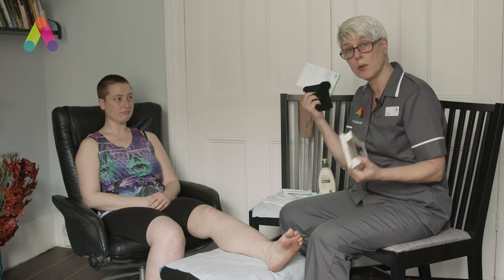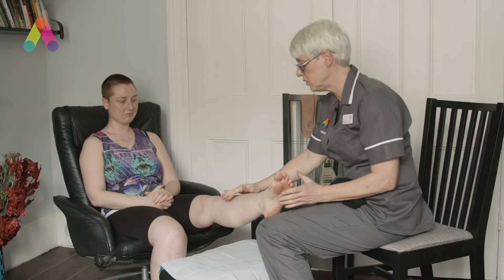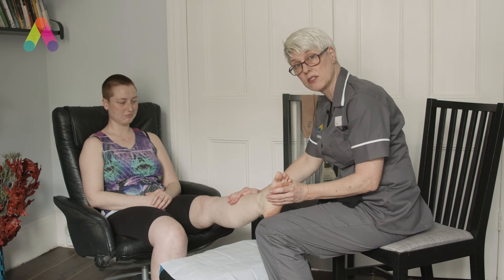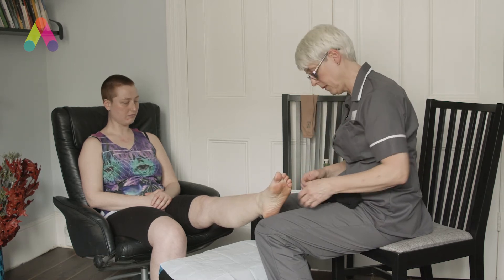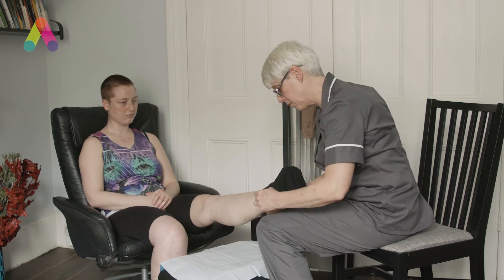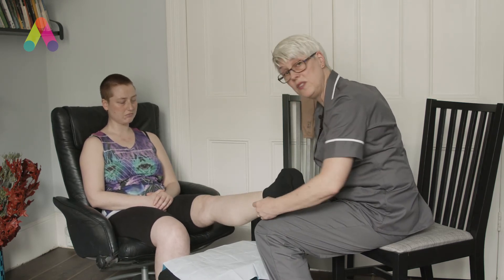So for Faith, our volunteer here, in the pack there will always be instruction guidelines for how to use the sock and how to wash it. We're going to assume that Faith has a wound on her shin — maybe a pre-tibial laceration or a skin tear. First of all, we would have cleansed the wound, measured the wound, taken a photograph of the wound for the records, and then we're able to moisturise her leg — skin care is very important as has been discussed previously.